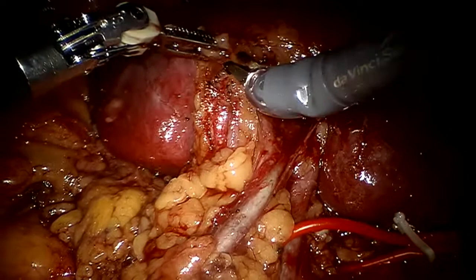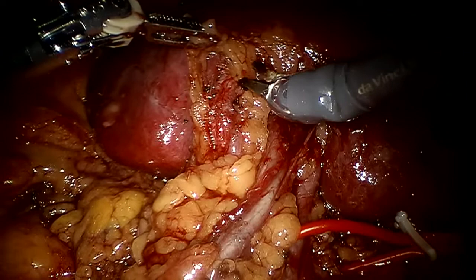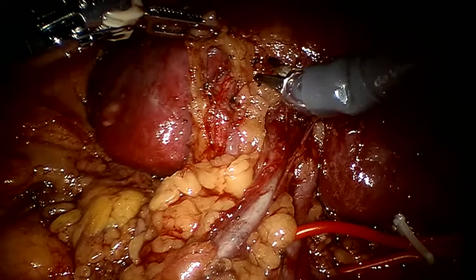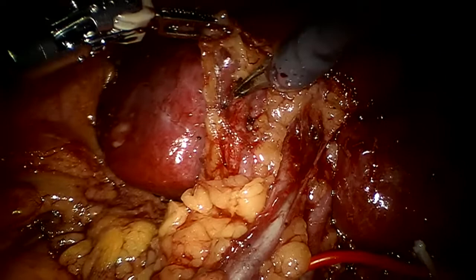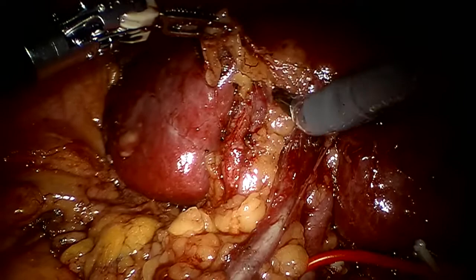because if I remember well, at the CT scan, this artery is very in contact with the tumor. Yeah, it's actually supplying the tumor. It's actually feeding the tumor. So if I find a branch, then I'll take it. If I don't find a branch, then I'm not going to take this. This is too big an artery. And we shall just see how it goes.